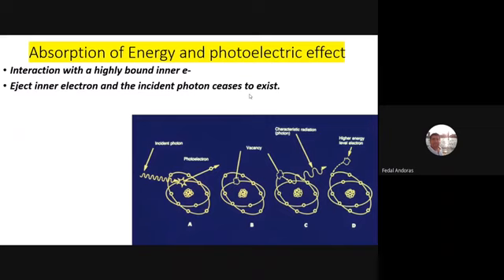This X-ray photon will end. It's not penetrating. At this point, when it hits the atom, this X-ray photon will be gone. It will be nothing, just do harm. It hit the atom, and many other reactions or processes happen as a result of this X-ray photon hitting this atom. Okay?